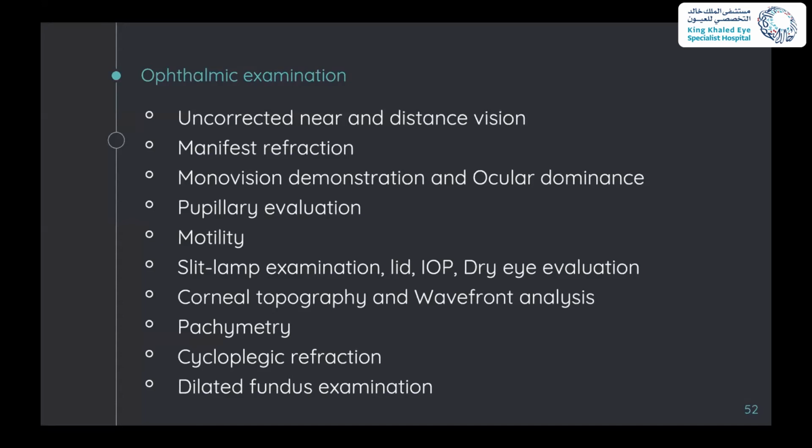Sometimes we ask for a wavefront analysis. It's not for every patient, but for some of the patients. For example, if the patient came to your clinic asking for refractive surgery, and they also tell you that they're having a problem during nighttime driving, this might suggest that they already have an aberration that you need to tackle. So here come the wavefront maps and analysis, which will give you a lot of hints and ideas.